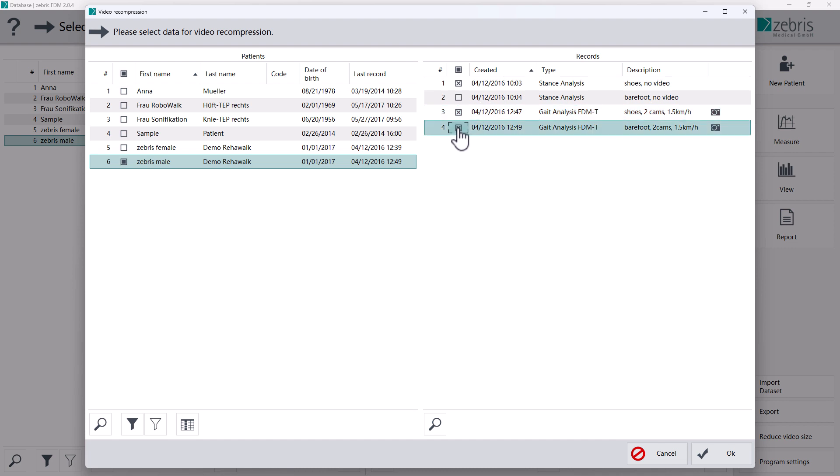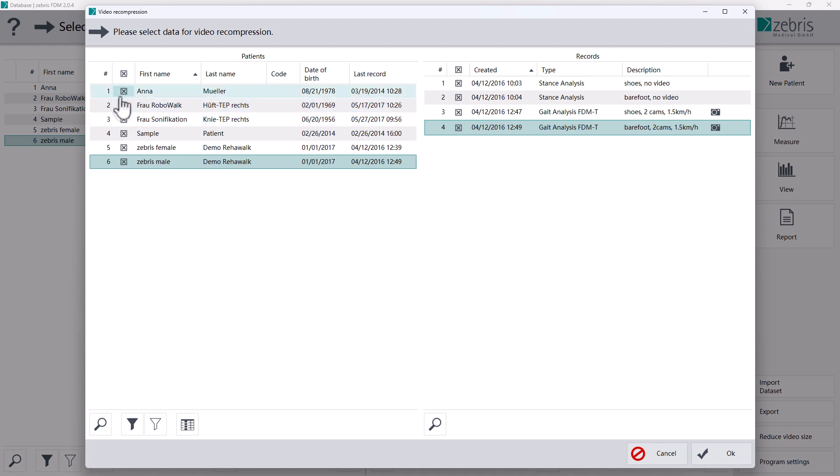If you want to select all data of a patient, click on the control field above the measurements. If you want to select all patients with all measurements, click on the control field above the patients.